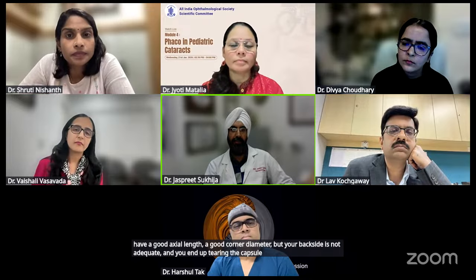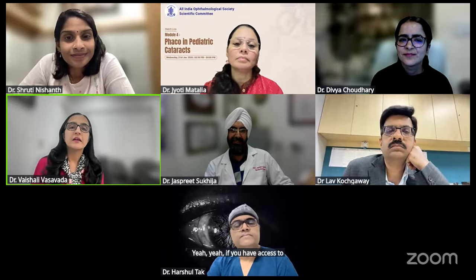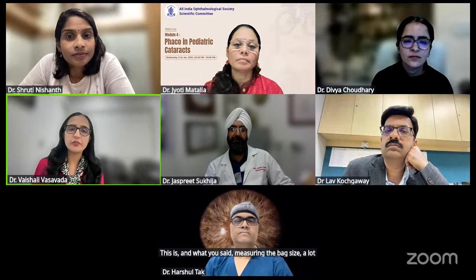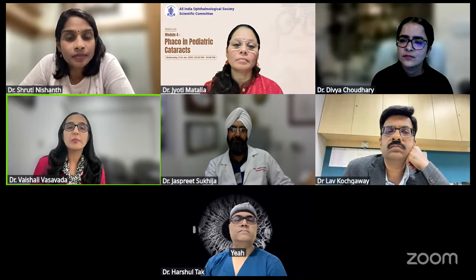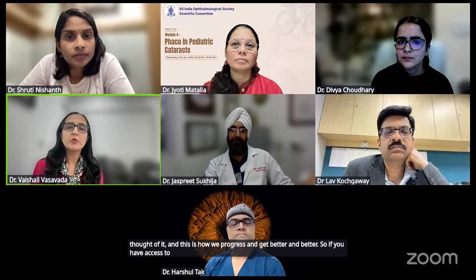But there are instances in older children where you have a good axial length and a good corneal diameter, but your bag size is not adequate, and you end up tearing the capsule when you're forcing an IOL. So measurements do help sometimes, and if you have access, why not? If you have access to UBM, and what you said, measuring the bag size, a lot of us never really thought of it, and this is how we progress and get better and better. So if you have access to UBM, you must get it.